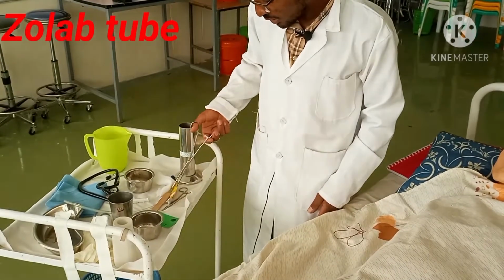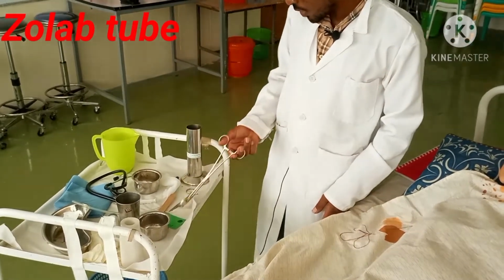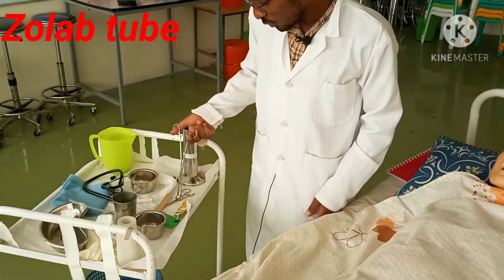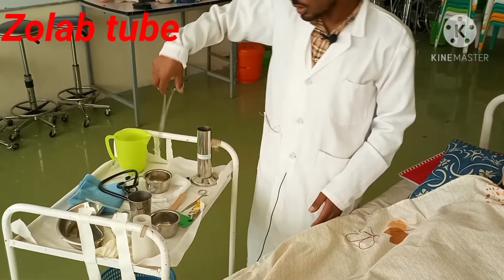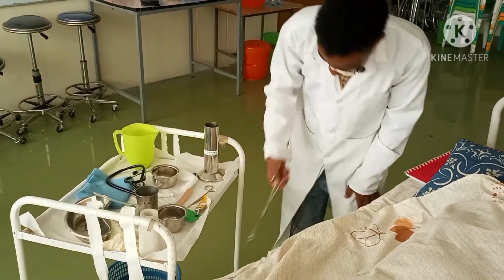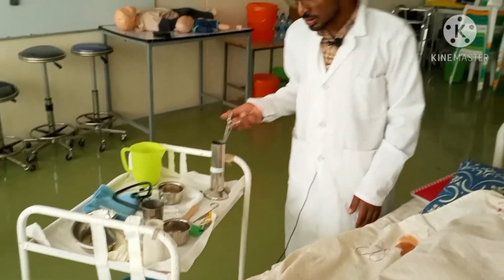We need also water soluble lubricant or KY jelly. Here is a clamping forceps. Here is a gauze. As well as we need a plaster and a jar of water, as well as a receiver. Here are the necessary equipment.